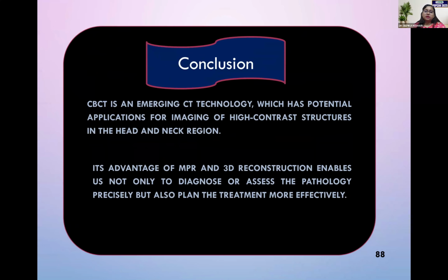Conclusion: CBCT is an emerging CT technology which has potential applications for imaging of high contrast structures in the head and neck region. Its advantage of MPR and 3D reconstruction enables us not only to diagnose or assess the pathology precisely, but also to plan the treatment more effectively.